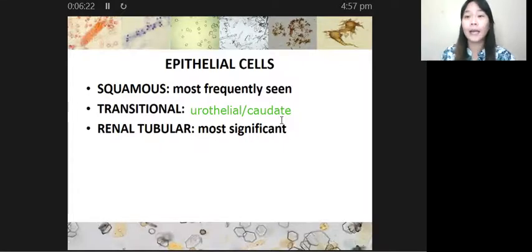However, yun nga, nabanggit ni Strasinger na transitional cells are cells of the urinary bladder. Okay, I have yet to check yung ibang references natin, yung mga old references natin like Moraleta or meron yung isa, Baker yata. Hindi ko pa sila na-check kung ginamit ba nila exactly yung term na bladder cell.